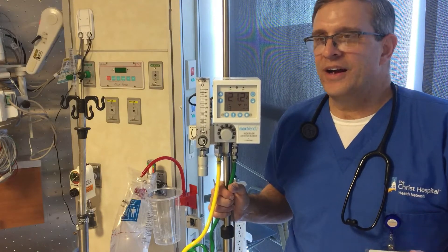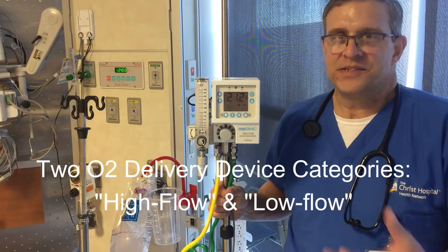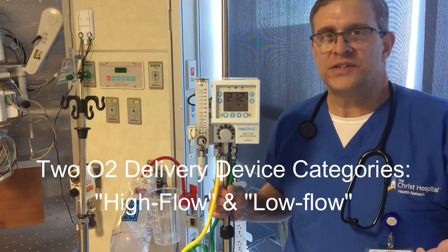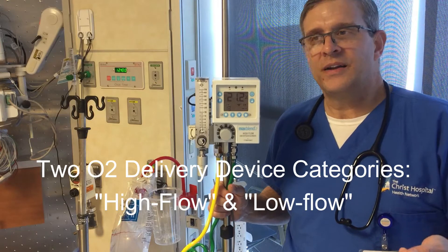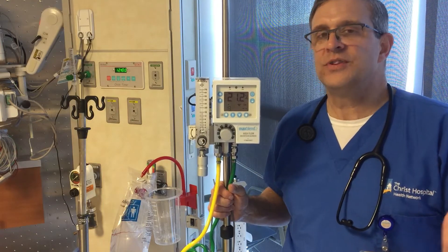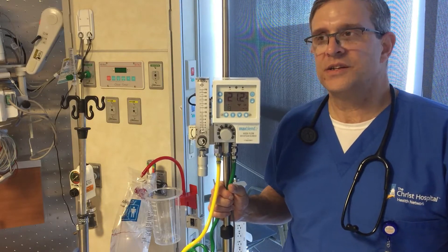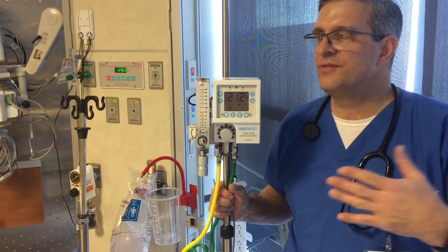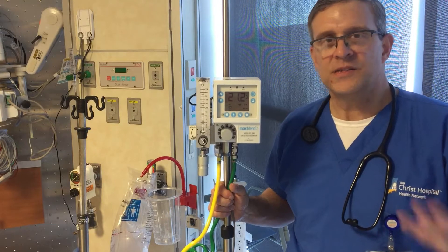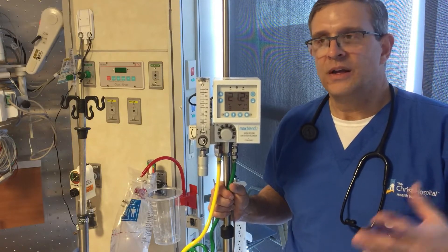Respiratory therapists can divide oxygen into two categories as it relates to typical oxygen devices. Low flow oxygen is typically measured in liters per minute. It's not an exact FiO2. It doesn't provide all of the patient's minute ventilation. It has a variable FiO2 depending on the patient's inspiratory flow, breathing pattern, respiratory rate, and tidal volume.